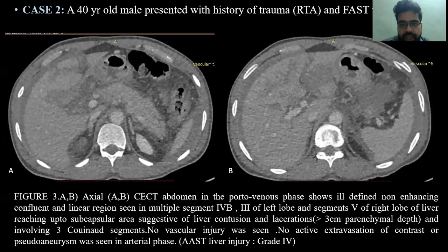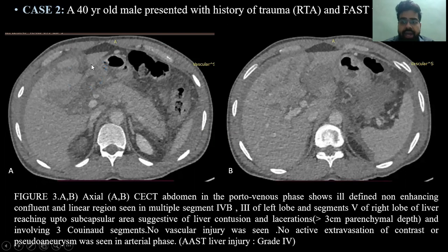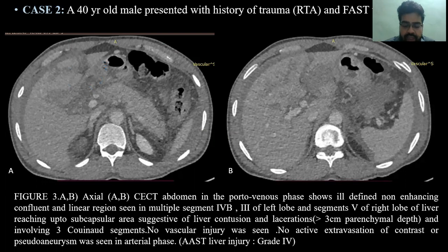Case 2: A 40-year-old male presented with history of trauma and was FAST-positive. The ill-defined non-enhancing confluent and linear region was seen in the liver involving bilateral lobes, reaching up to the sub-capsular area, consistent with liver contusion and laceration. The parenchymal depth was more than 3 cm involving 3 Couinaud segments. No vascular injury was seen. This was graded as AAST grade 4.